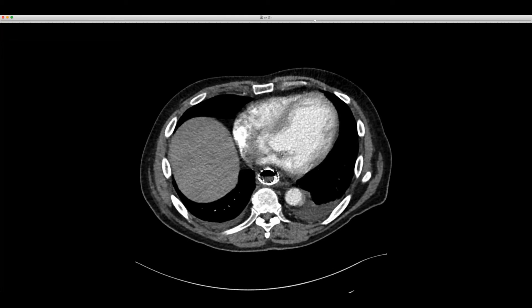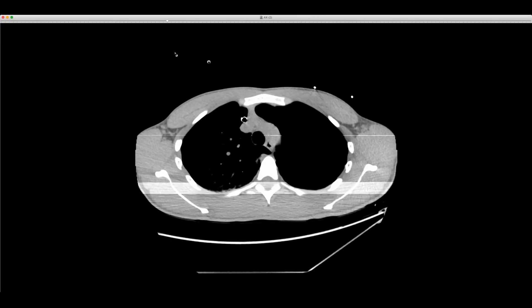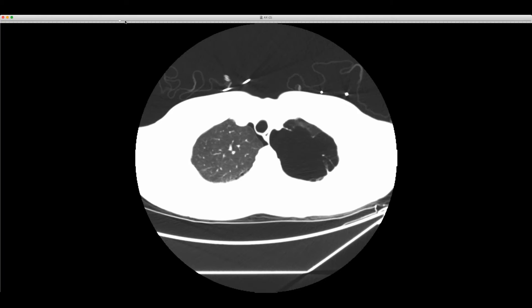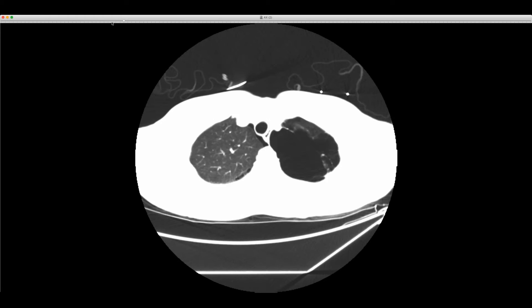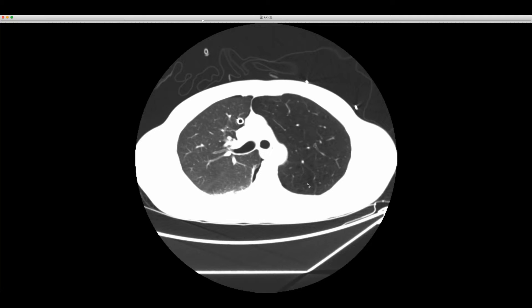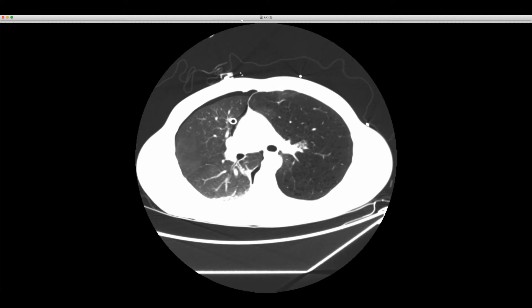This next case is a young patient in their 30s with a significant history of smoking who came in with a pneumothorax. You can see the chest tube, the residual pneumothorax, some blebs and emphysema at the apex, and large bullae at the left lung apex. As you come down, the lung is dramatically different in attenuation — diffusely low attenuation with areas of centrilobular emphysema scattered throughout.